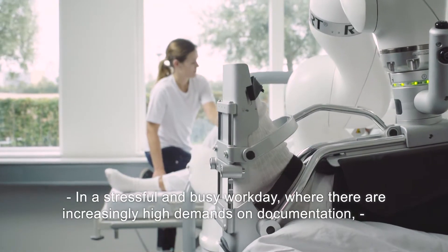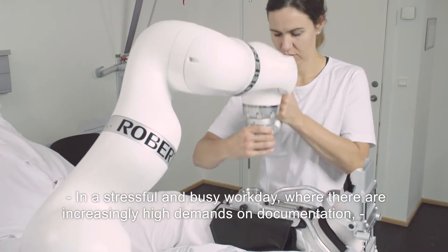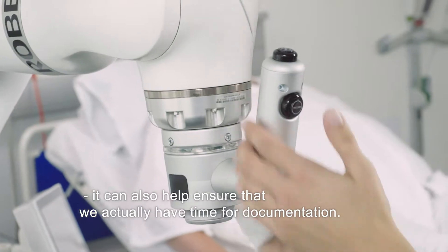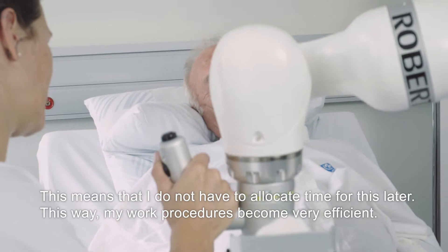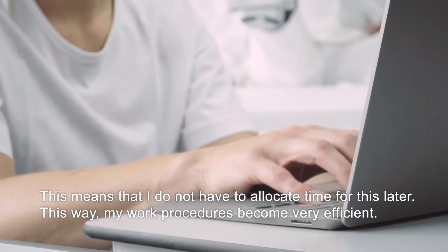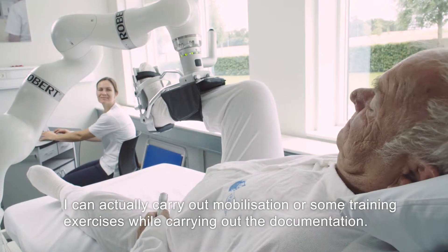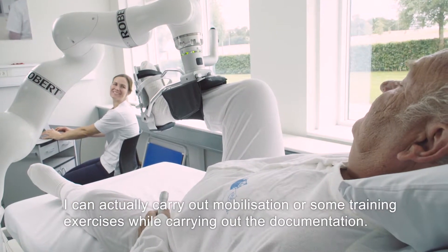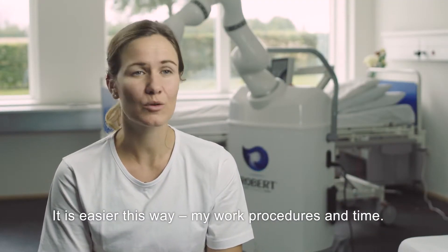In a stressed and busy day, where there are more and more demands for documentation, Robert can also ensure that we have time to document it. I'm getting really effective in my work — I can perform a mobilization or training exercises and still have time to document it. It makes my work and time much easier.